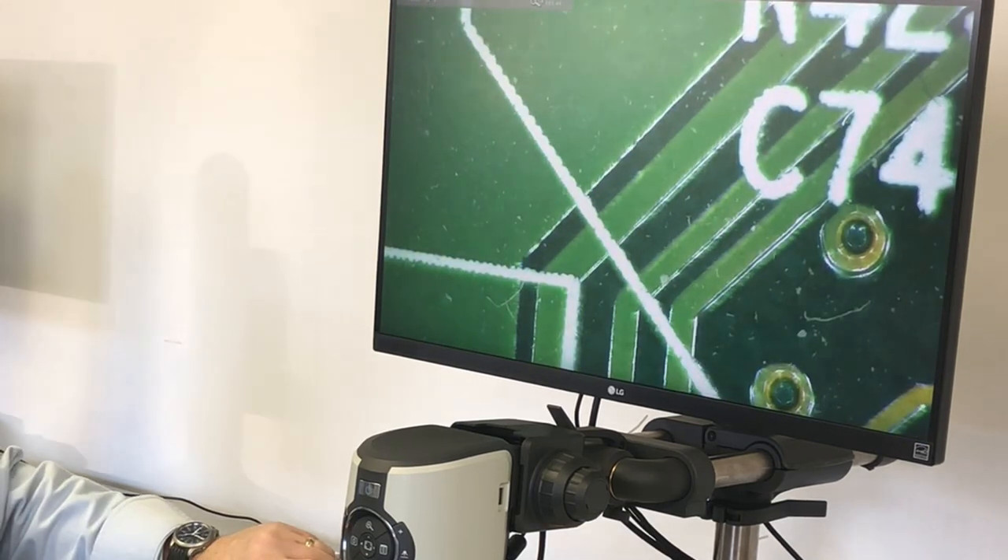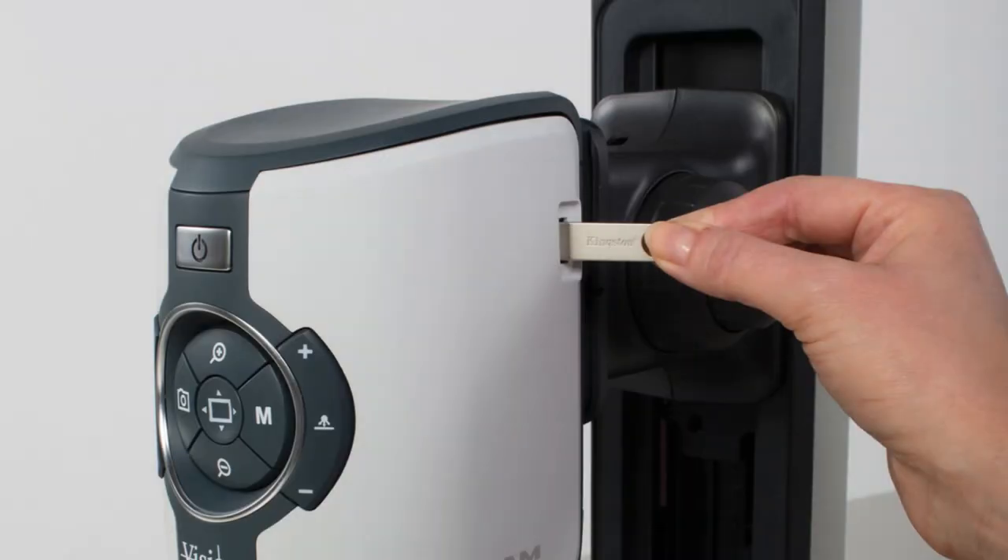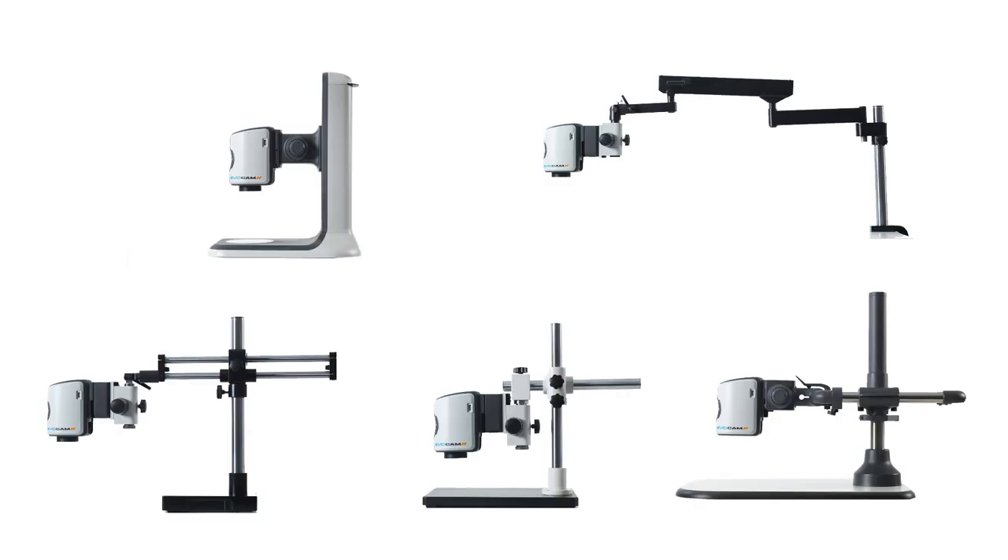Auto focusing, auto exposure, instant image capture — these are areas where the EvoCam 2 shines.